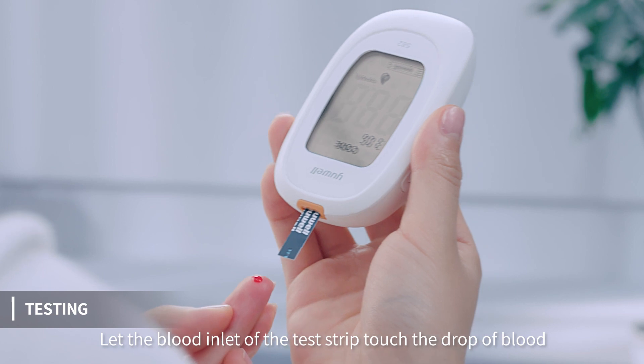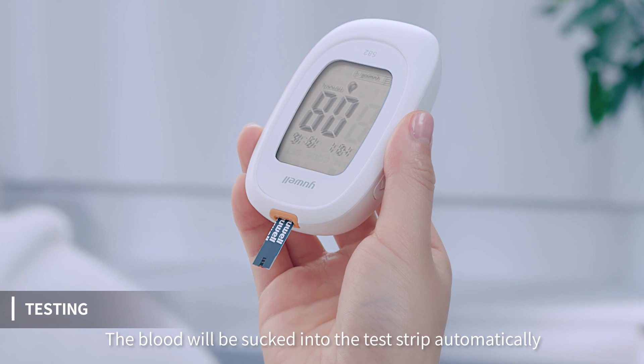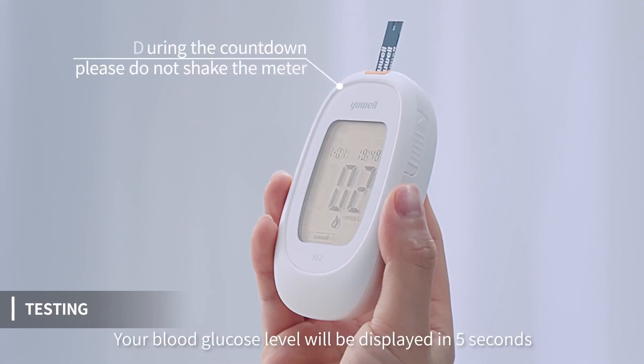Let the blood inlet of the test strip touch the drop of blood. The blood will be sucked into the test strip automatically. Your blood glucose level will be displayed in 5 seconds.